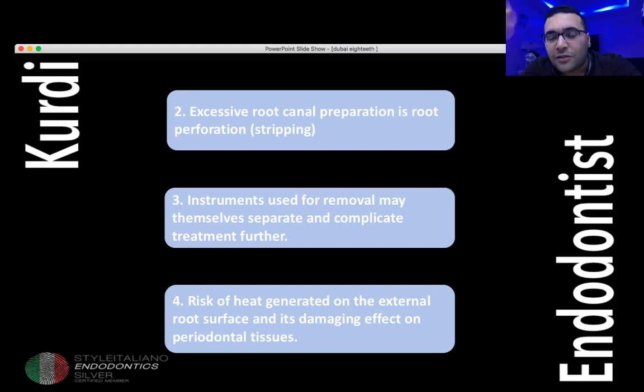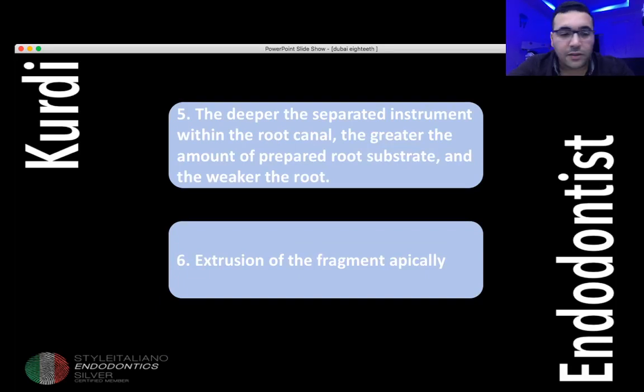or a lot of used ultrasonic tips, and also, and this is very important, the risk of heat generation, because the ultrasonic just makes a lot of heat. We have some studies talking about if the increase in temperature is about 10 degrees, it will harm the dentin, and nowadays this conclusion is not accepted anymore, because 10 degrees above the body temperature will not cause any harm to the bone and even to the periodontal ligaments around it.